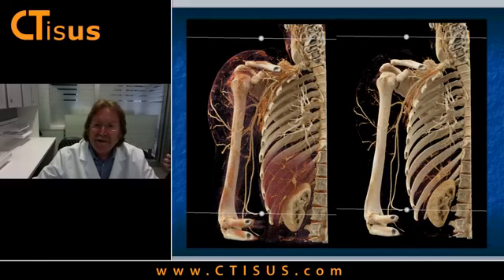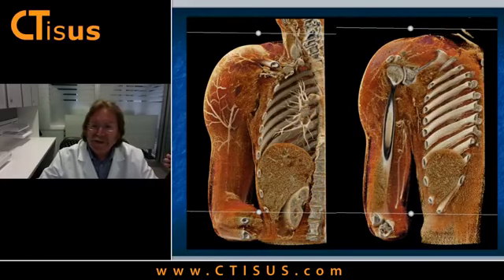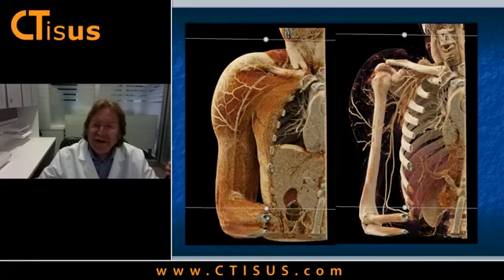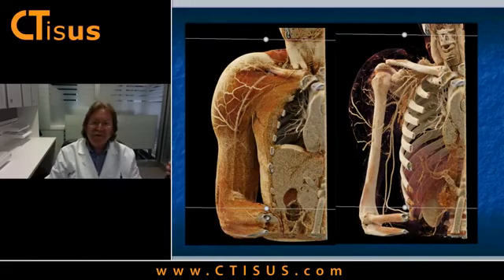Then I'll just switch over a little bit, and now I'm bringing you the muscle. You can see the increased vascularity. You also can see the decreased attenuation in the muscle. It's amazing what a nice look you also have at the lungs, the ribs, pulmonary arteries, liver, and kidneys within that shot. And then I'll show you a little bit more, giving you a little bit of the induration, infiltration of the muscle, as well as the prominent vascularity in the muscle. And finally, here's a little bit of a different view of that. So you can see very nice detail, bone, vessels, muscle.